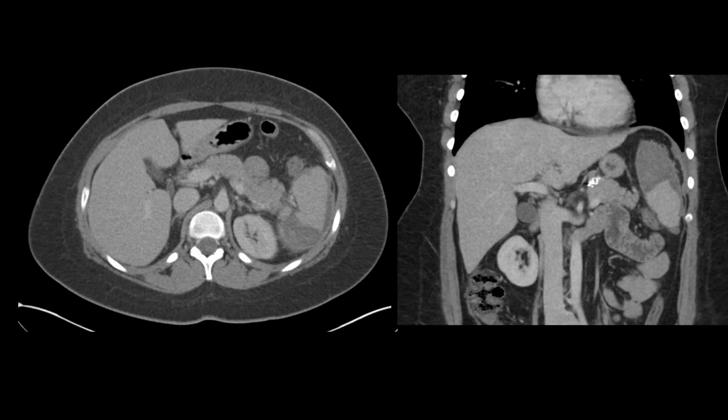So we have a 3-month follow-up for this case, and kind of what I was describing is exactly what happened. We have our plug here in the proximal splenic artery, and we still have some enhancement within the spleen. Yes, there's definitely some devascularized portion of the spleen and some evolving hematoma, but hopefully this is enough to give them the support they need, or the splenic function that they need.